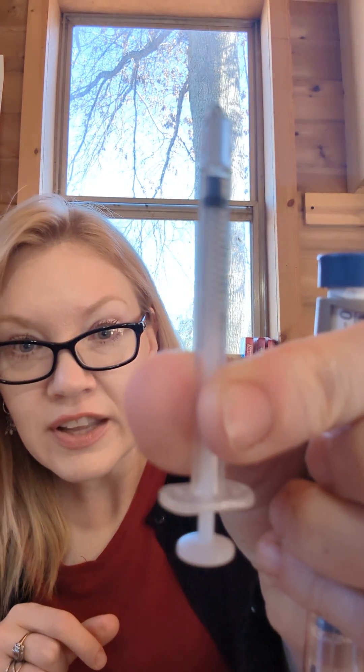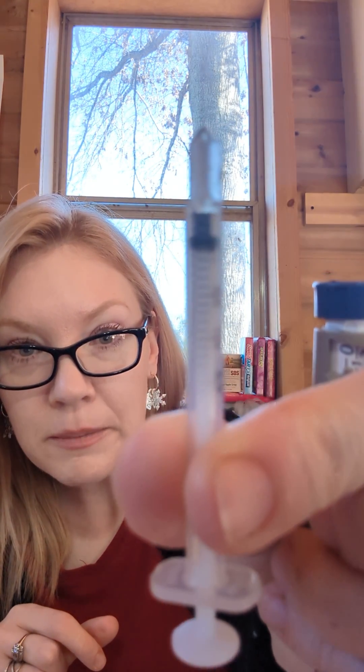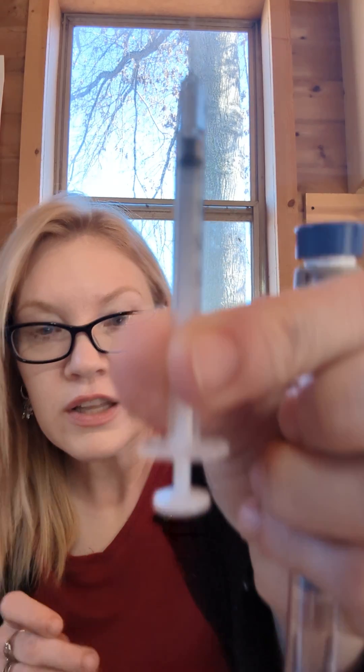I have half a unit there. One caveat when pulling insulin out with a syringe: you cannot use the pen as a pen after this. You'll need to continue using a syringe to pull out your insulin, because it can disrupt the mechanism and it could dose inappropriately. So if you're going to pull insulin out with a syringe, just continue using it with a syringe.